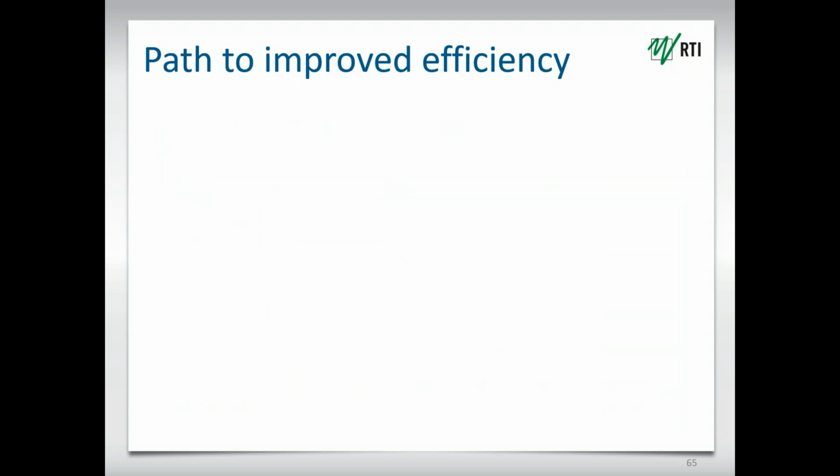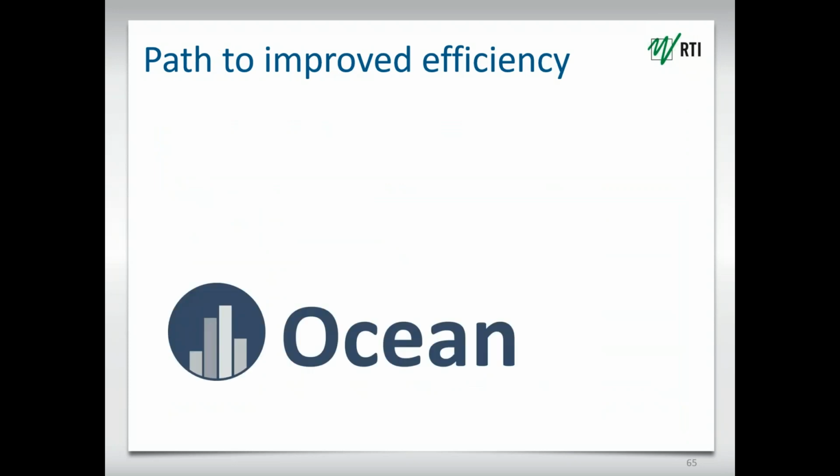So looking at the path to improved efficiency, the way that we see it is, of course, the foundation being the Ocean software. The first step that we can take today is utilizing the Ocean Quick Check and exploring the possibilities that it represents as an off-the-shelf solution.